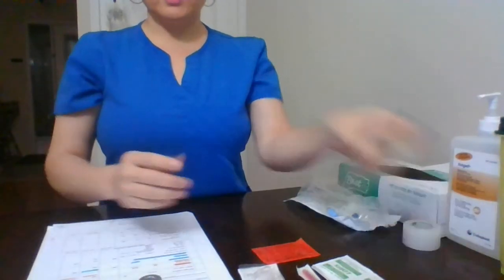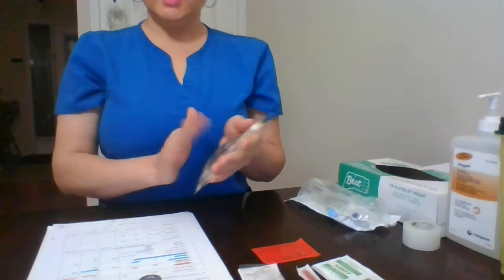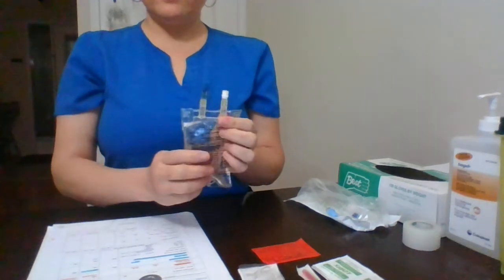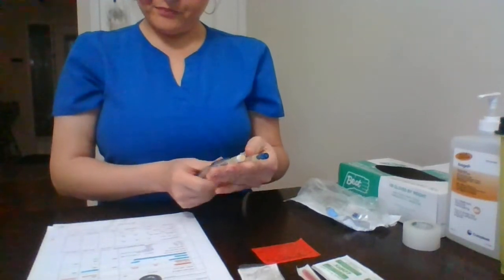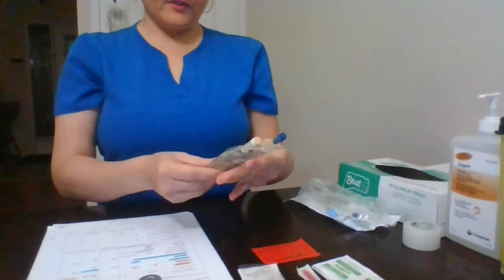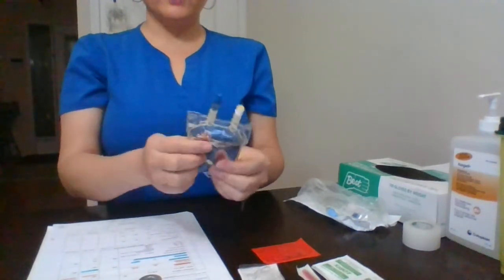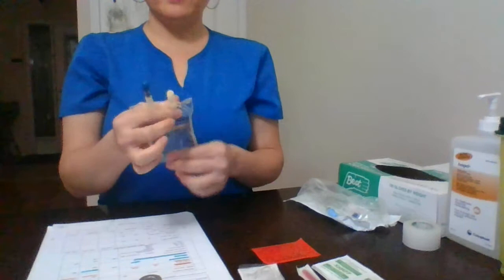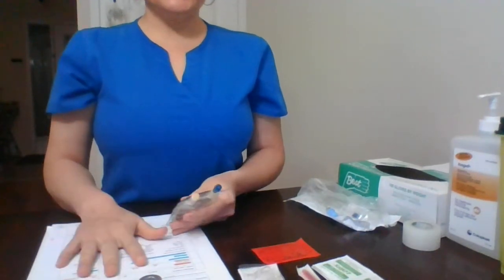And the other thing I will also do is to verify our mini IV, which is 50 ml. And I will check for the expiry date, which seems fine here. And I will also check for any discoloration of the packaging or the solution inside my mini IV, which seems good. So we did our first check.